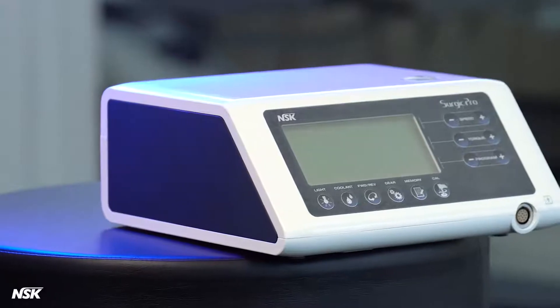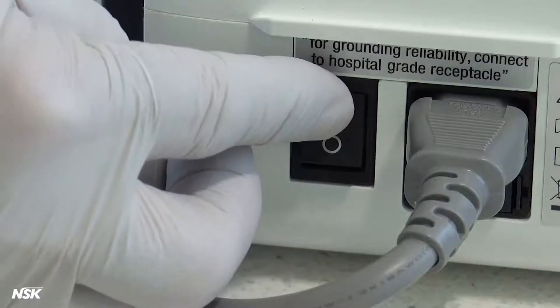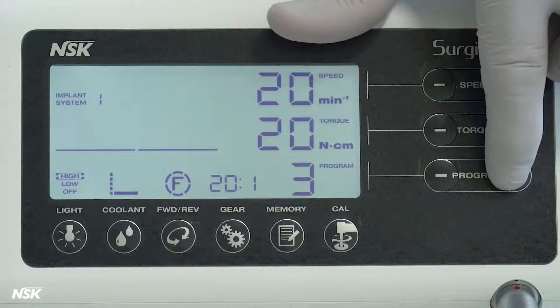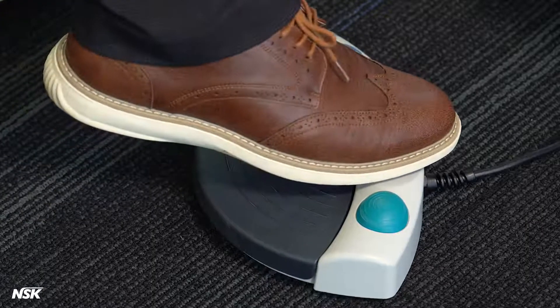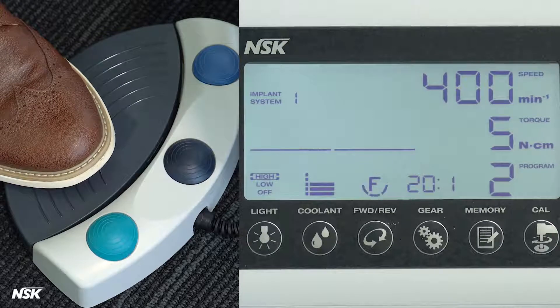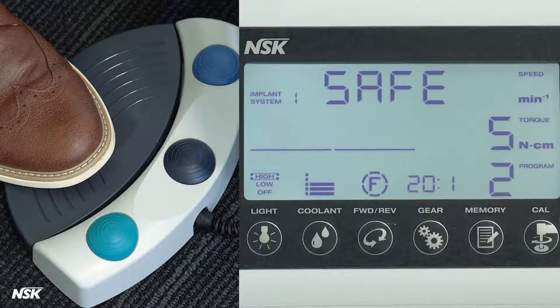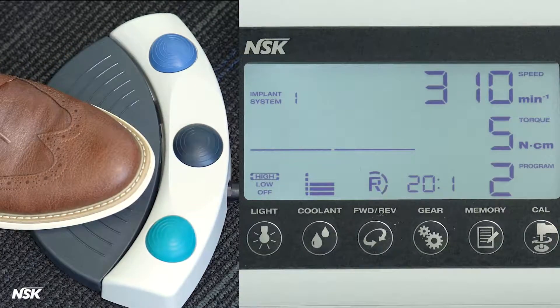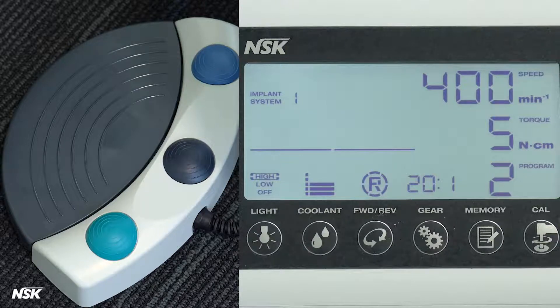To operate your Surgic Pro, first turn on the power using the main power switch. Select the desired preset program number by pressing the plus or minus on the panel, or the black button on the foot control. Verify the program details, then step on the speed control paddle in the middle of the foot control to run the micromotor and the pump. If a drill becomes stuck in the bone and the torque exceeds the set value, the error message 'safe' will appear on the panel — you will hear a beep and the device will stop. Tap on the speed pedal to clear the error, then press the green button on the foot control to change the rotational direction and step on the speed control pedal again to release the drill. Don't forget to change the rotational direction back to forward, and you're ready for another round of drilling.